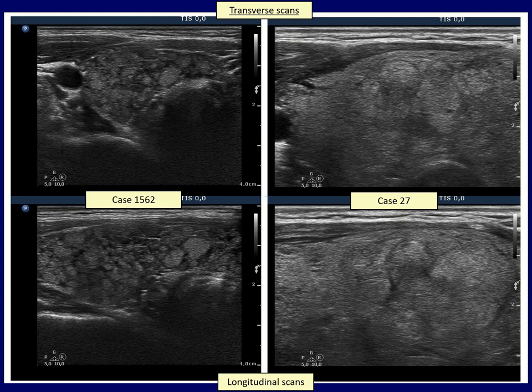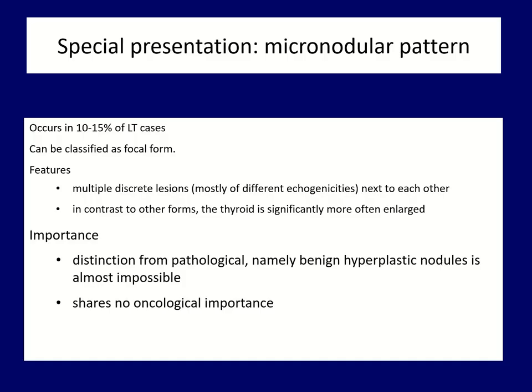The right case illustrates the differential diagnostic issue of the macronodular form. It is frequently impossible to decide whether these discrete lesions are pathological nodules or not. Although differentiation from true nodules is frequently impossible even in histopathology, fortunately the differential diagnostic issue does not involve thyroid cancer. In contrast with the focal form of thyroiditis, this pattern does not cause oncological concern.